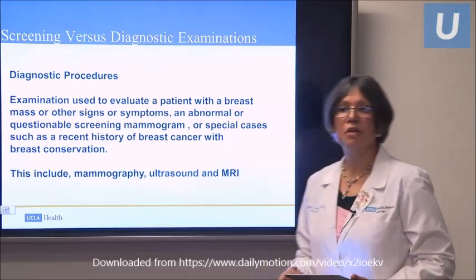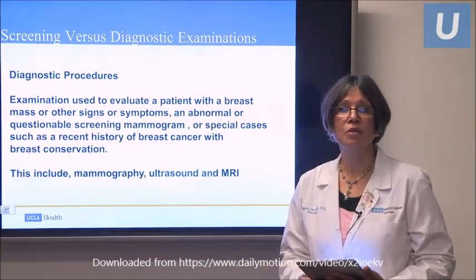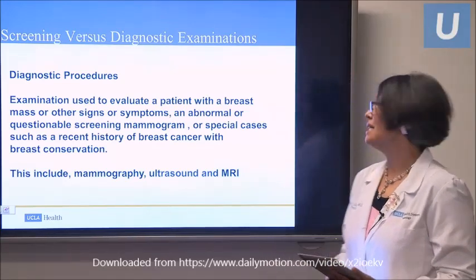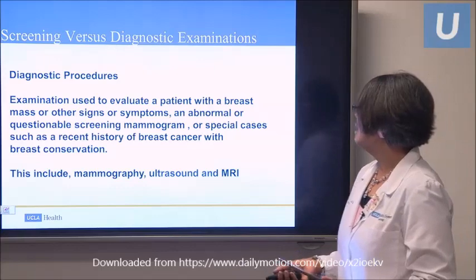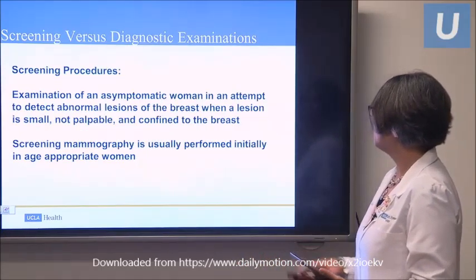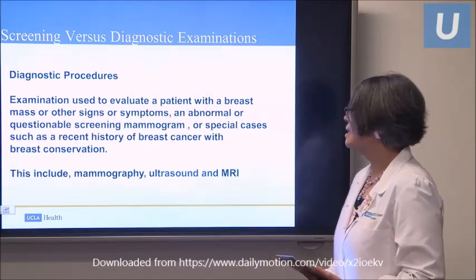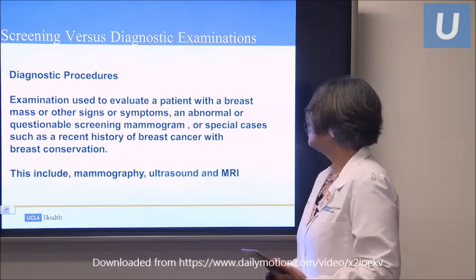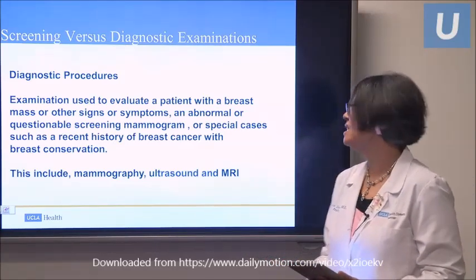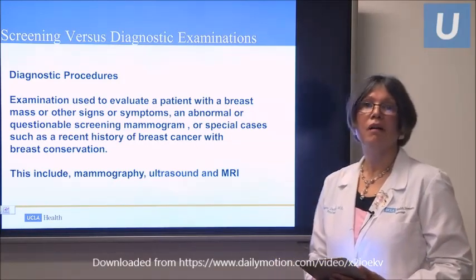Or if your doctor, after you've had surgery, wants you to come in post-surgery to make sure that there's no residual disease, that again is a diagnostic examination. So again, screening is for asymptomatic women to detect small lesions not palpable and confined to the breast. And diagnostic is what we can use all of our tools of mammography, ultrasound, or MRI, depending upon the case-by-case basis. And those are women who are symptomatic or are post-surgical.